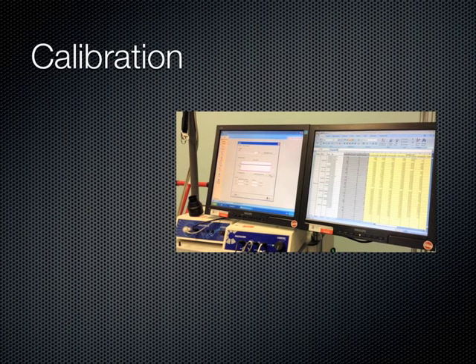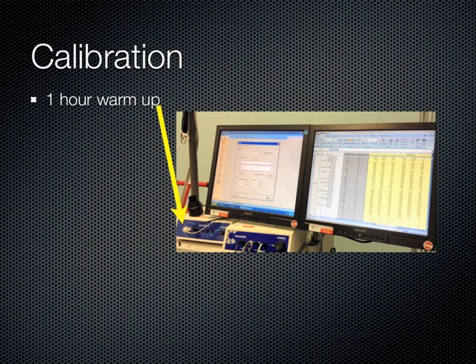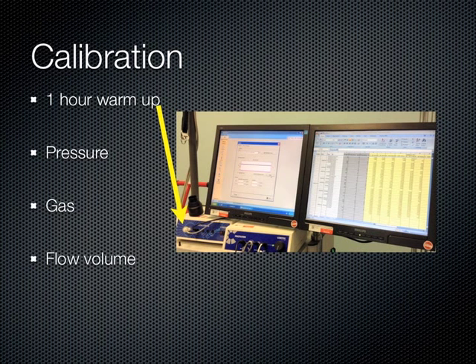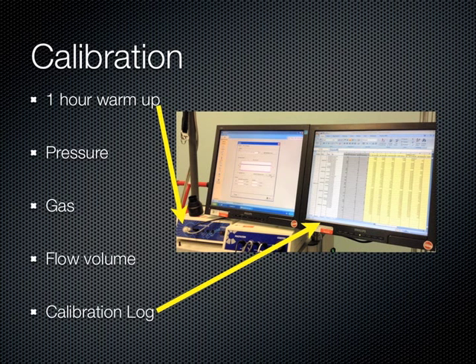The gas analyzer should be switched on one hour before its intended use. The three things we calibrate for before beginning a test are pressure, gas, and flow volume. The order they are calibrated in does not matter. Calibration requires that these are both measured and then checked against the CPEX guideline preset values. All the calibrated values for each test are recorded in the calibration log.